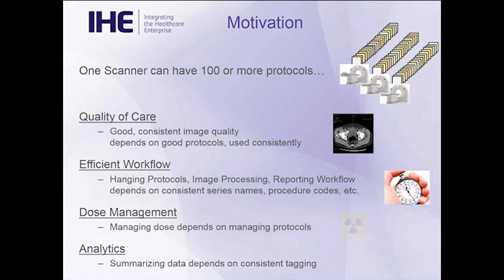So all of this gets messed up unless there's consistent use of series names, procedure codes, and the like in the protocols. For managing radiation dose, if you're going to manage the dose, you have to manage the protocols. Having protocols that have been designed for appropriate levels of dose and then using them consistently for different age groups and weight groups and the like is sort of a cornerstone of doing good dose management.